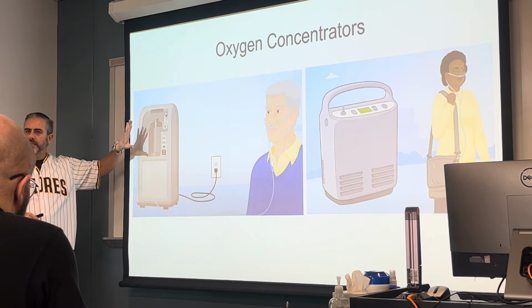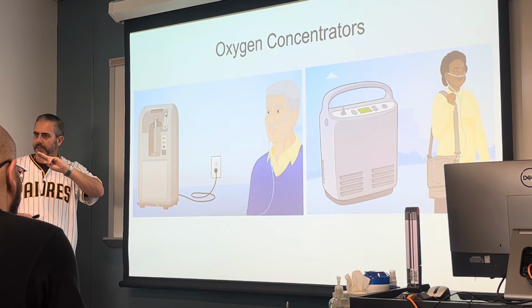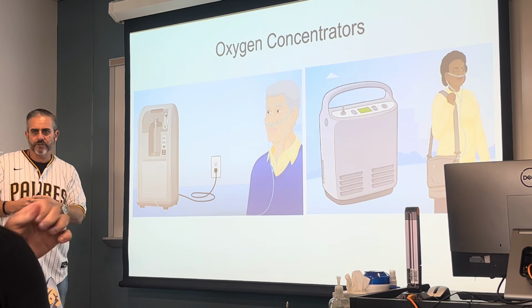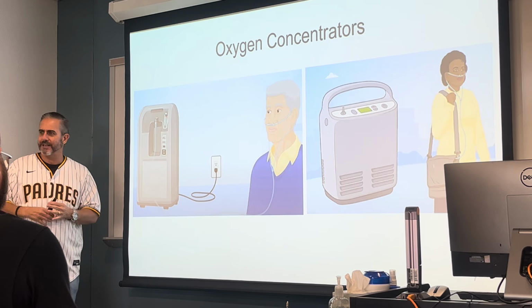When a patient's wearing oxygen in the home, and they're told, hey, you need to wear your 2-liter nasal cannula. And you know, we're just as bad as anybody else. Well, if 2 liters does a good thing, 3 liters should do better, right? If 1 pill works, well, 2 pills should work better, right? That's kind of the strategy sometimes.